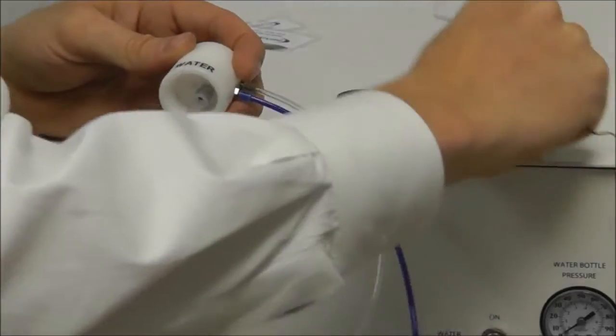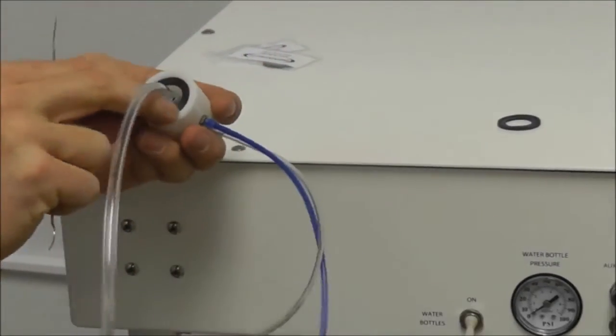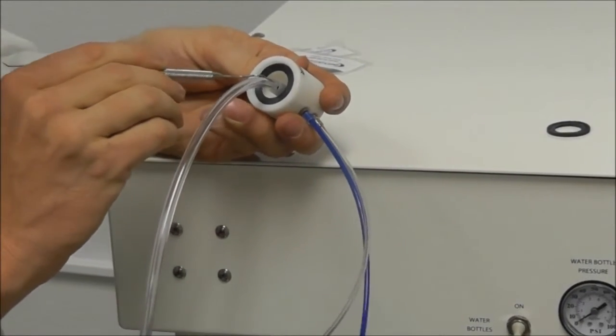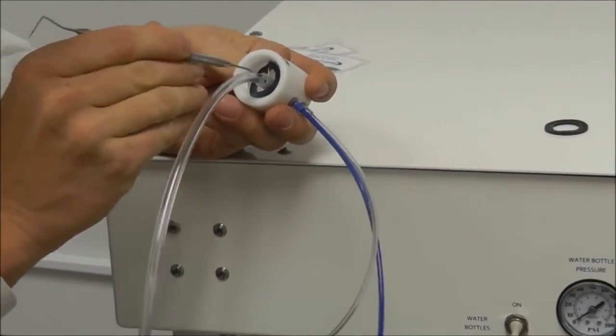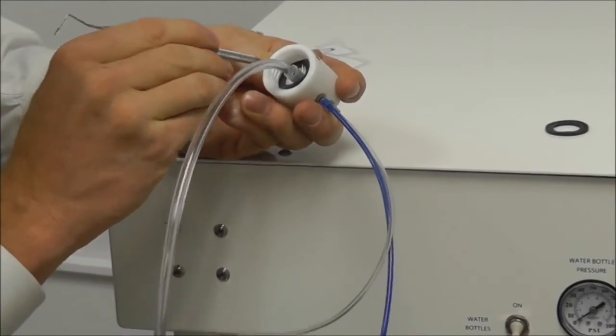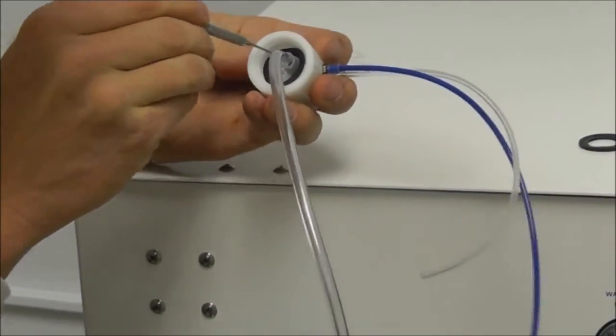And that's the old one. And the new one here, we'll just slide that up on there as well. With your Explorer, you want to get one end down in there so you can push it back underneath the lip, and then just kind of work it around.